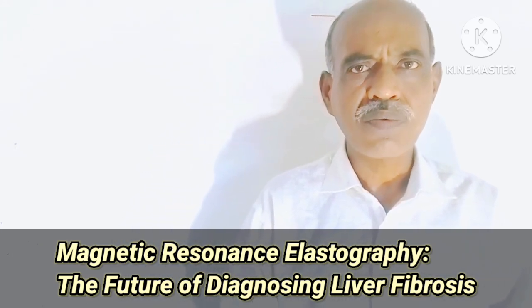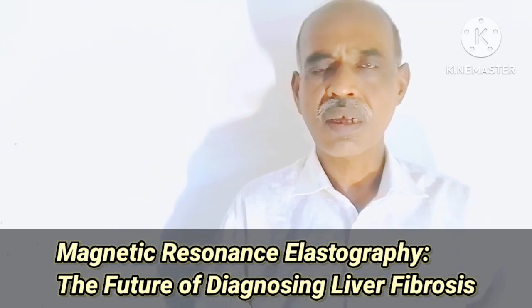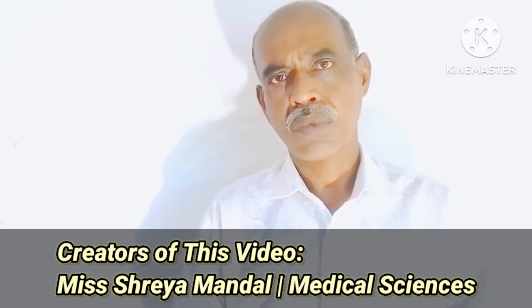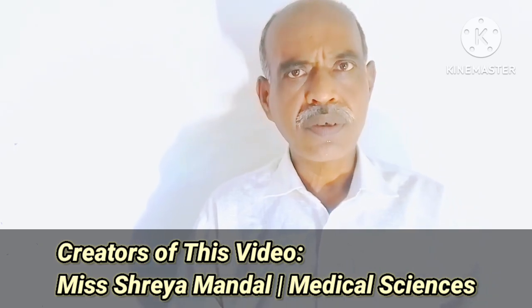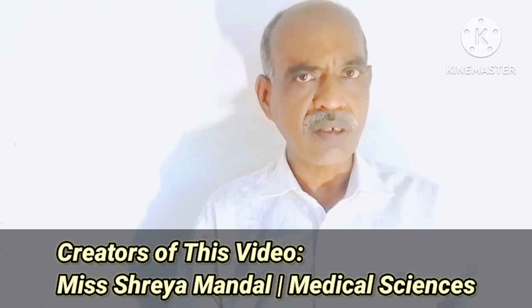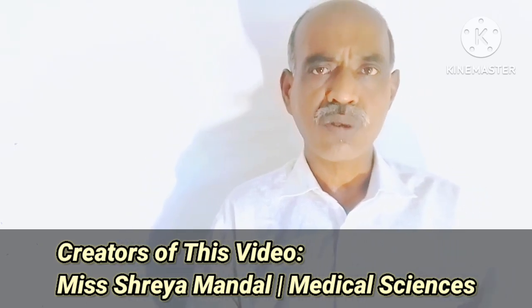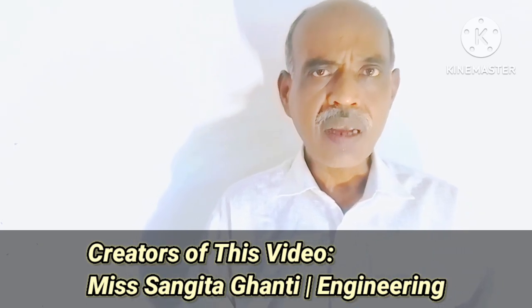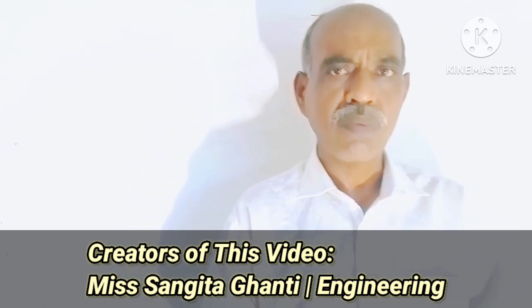So to measure the stiffness, this technology is used, known as MRE or magnetic resonance elastography. So here what is done actually, sound waves combined with MRI, that is magnetic resonance imaging, that is known to you. So here a combination of sound waves and magnetic resonance imaging or MRI is used. And this pairing works very well to measure the stiffness of liver in case of a liver fibrosis.